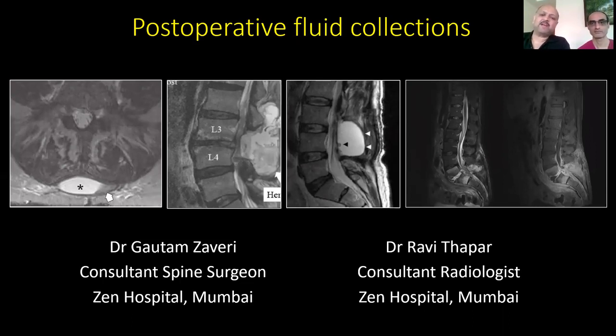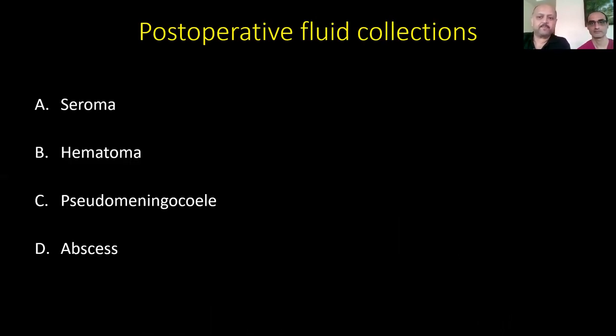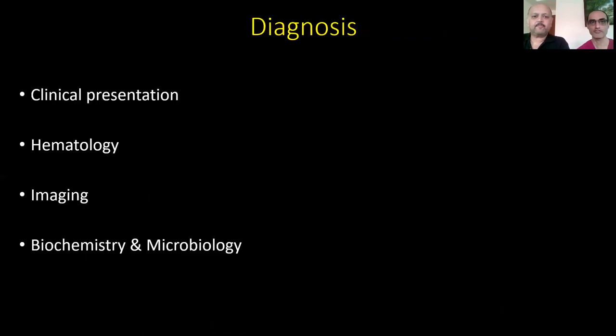Sometimes the patient may present for some other problem and diagnostic imaging may show a fluid collection. It then becomes extremely difficult but vital to try and precisely diagnose what the fluid collection is. The 4 most common fluid collections that we routinely encounter are the seroma, hematoma, pseudomeningocele, and abscess.